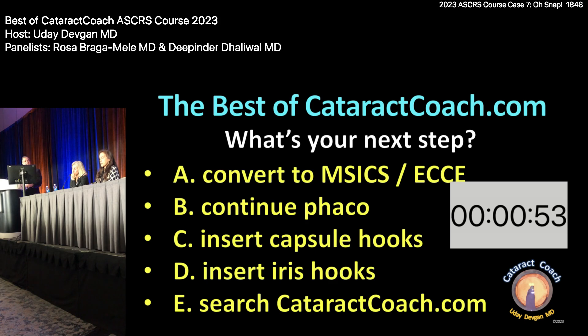Would you change any parameters? Cut the flow in half — not too much. It looks relatively dense, so take that into account. You could do an M6 and pull it out, but you're going to have vitreous following it. I think that nucleus is already entangled with vitreous — that's why it's so difficult to get it rotated. On these cases, I can't help but think that hydrodissection to the sides rather than straight across would have been better — but more importantly, recognizing what had happened sooner.